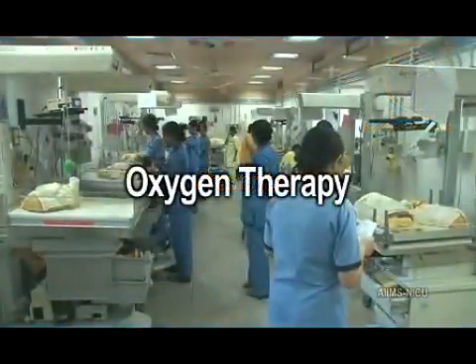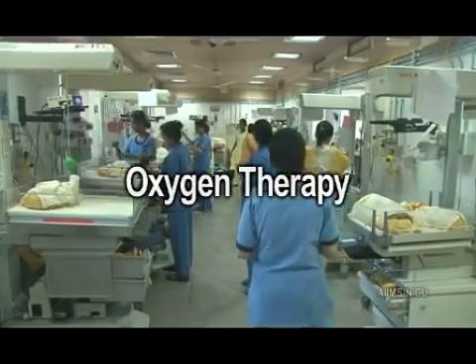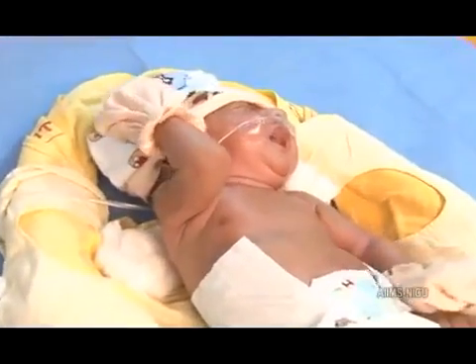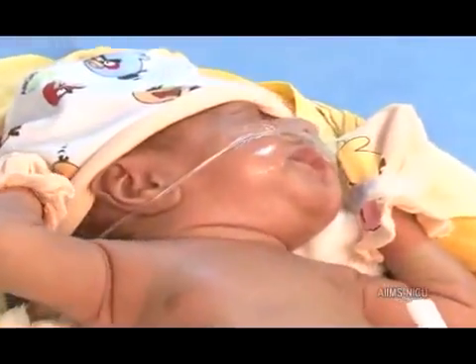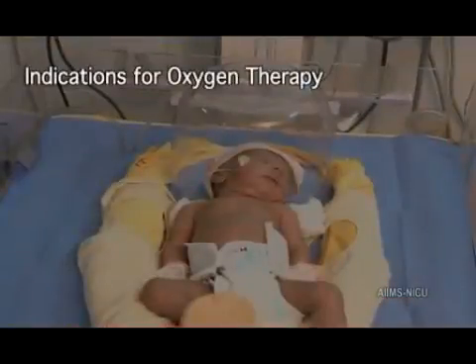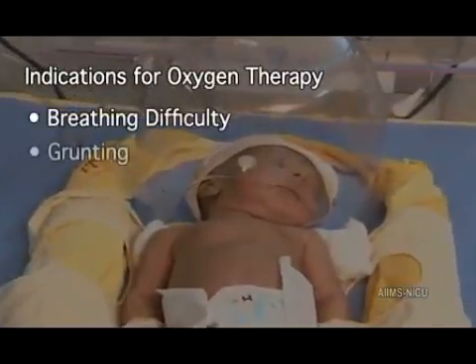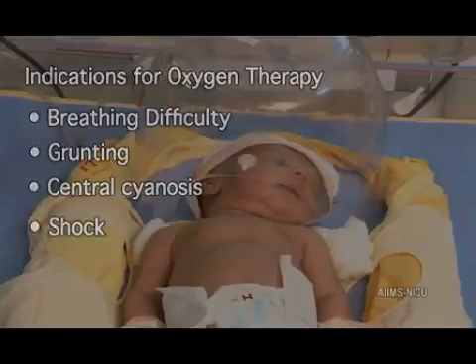In this video, we shall learn about oxygen therapy by hood and by nasal cannula. Administering oxygen to sick neonates helps to relieve hypoxia, thus improving the oxygen supply to the tissues. Oxygen therapy is indicated in babies with breathing difficulty, with grunting, with central cyanosis, or with shock.